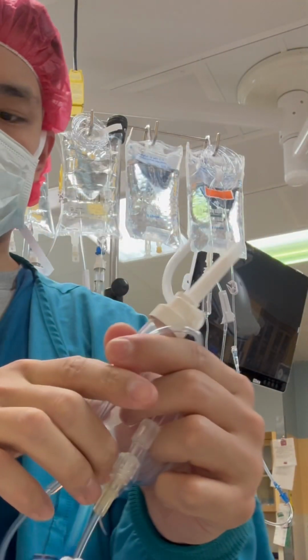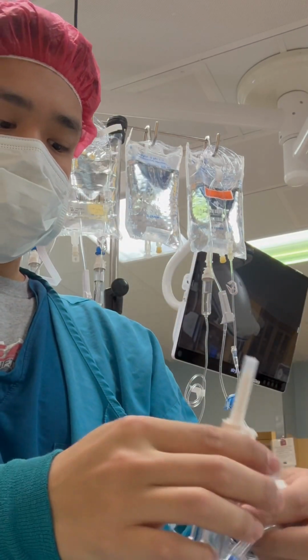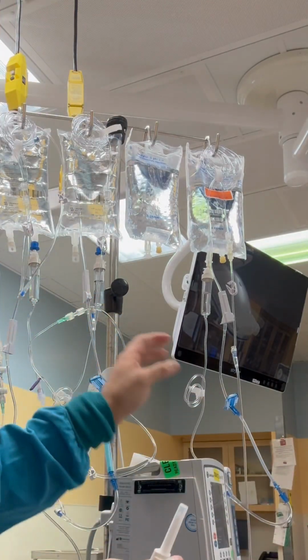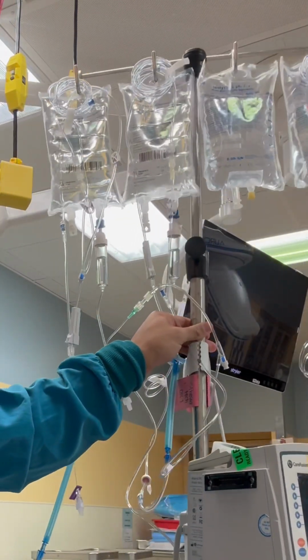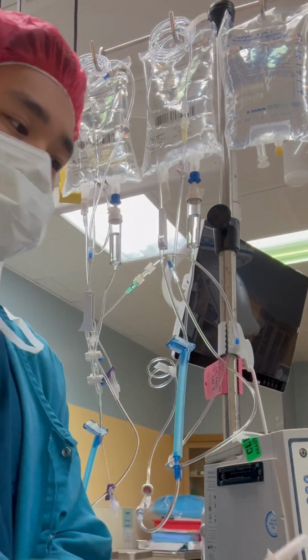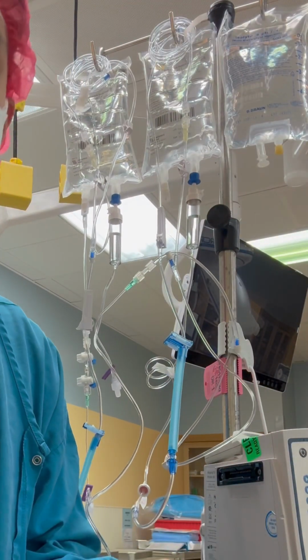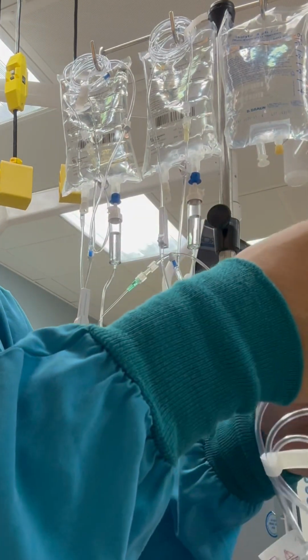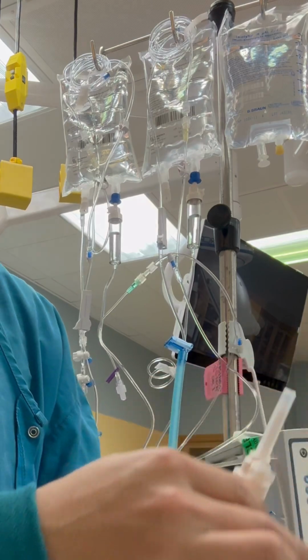Today I'll be showing you how to prime an IV fluid line for kids. It's super important with kids to have zero air bubbles in your line because kids can have, you guys know this, undiagnosed atrial septal defects, ventricular septal defects, or other congenital stuff. And if a tiny bit of air gets in, then they can have a paradoxical embolism. So we don't want that.